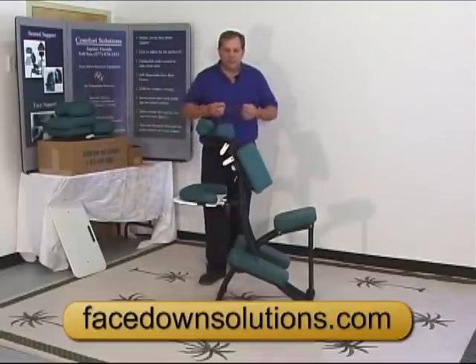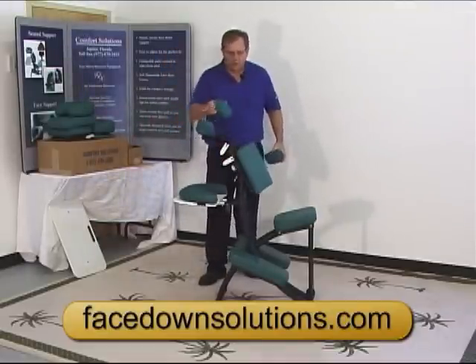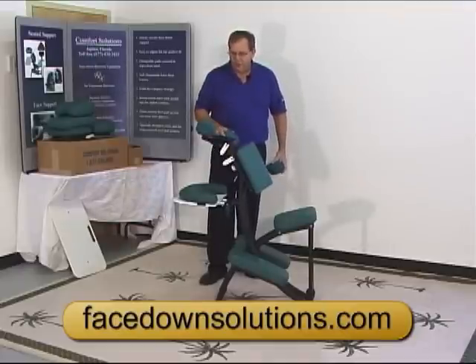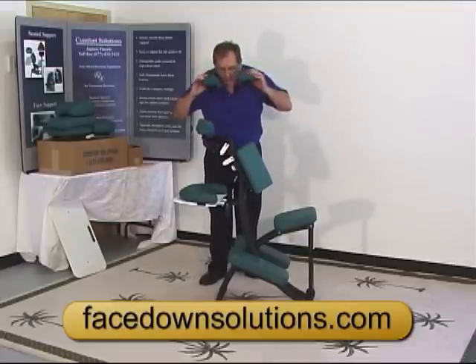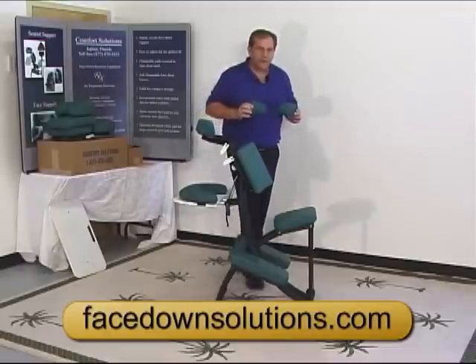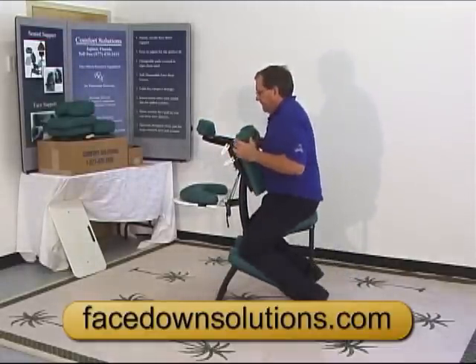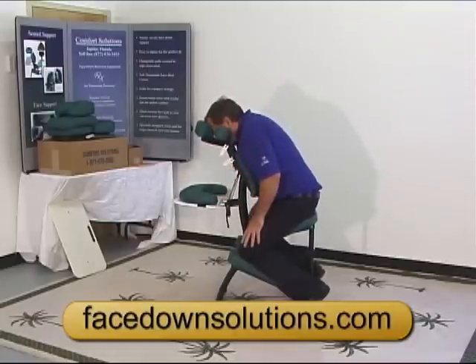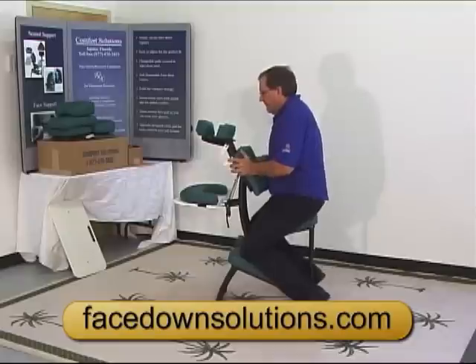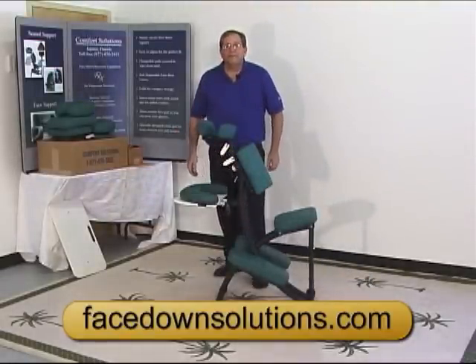To adjust the cushions, take the cheek cushions — I'm going to sit in the chair, lean forward, take the cheek cushions, put them to my cheeks, lean forward, and that will position the cheek cushions correctly. That's pretty much all you need to know about the chair.